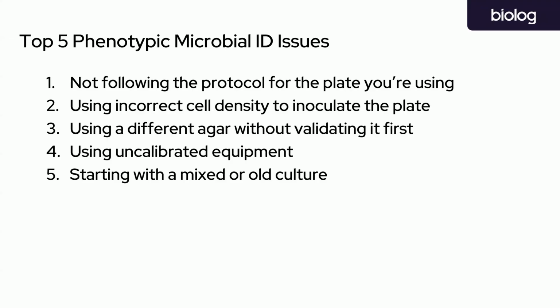We have worked really hard to make these protocols as generally applicable as possible. So it's important that they're being followed to get the best and most reliable results. Also, using incorrect cell density to inoculate the plate, or using different growth media as your pre-culture instead of the ones that we recommend. And additionally, using uncalibrated equipment or starting with a culture that's too old can also really negatively impact results.